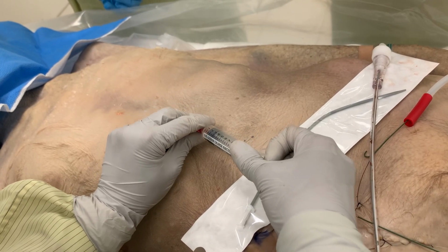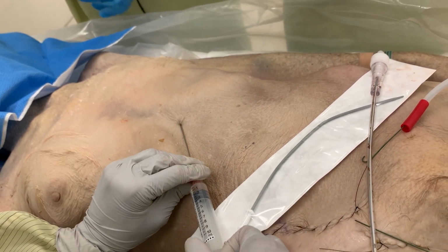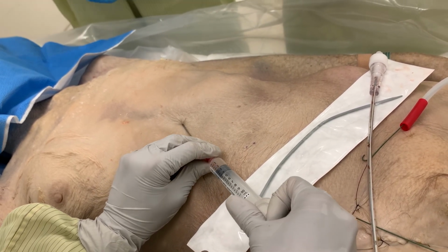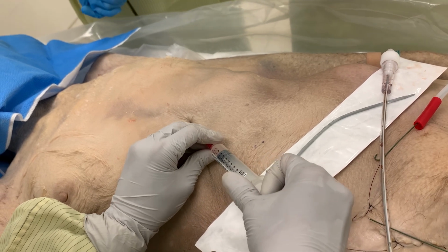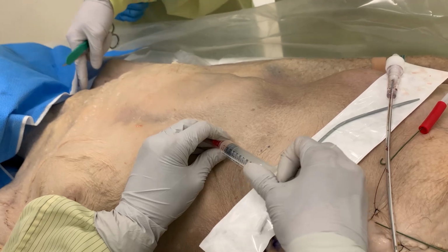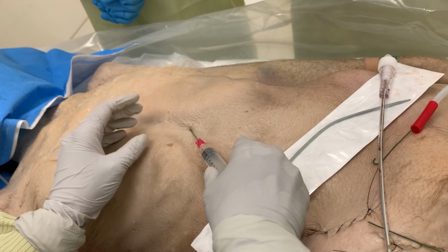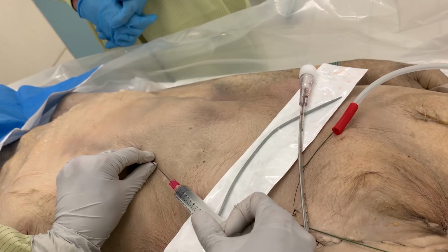The distance from the skin to the pericardium is based on body habitus. If no fluid is obtained, withdraw the needle to just under the skin and angle the needle more posteriorly, closer to 30 degrees, and re-advance the needle while continuously aspirating. Remove and flush the needle after several failed passes.